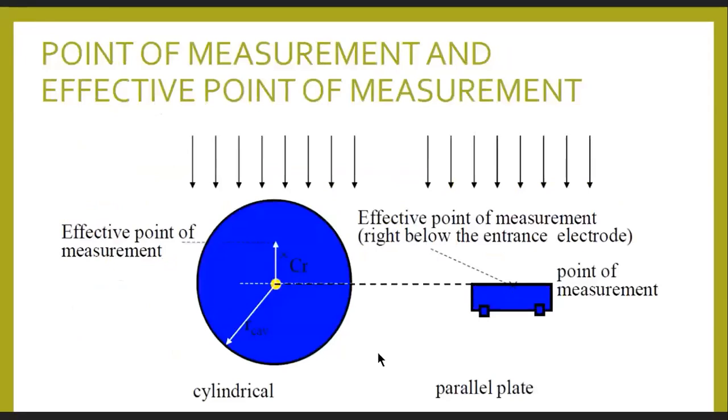Okay. Since we're talking about the measurement of percent depth dose in water, this protocol also defines the point of measurement, how to place or position your detector, your dosimeter, in water in order to measure the PDD and to make a reference dosimetry.